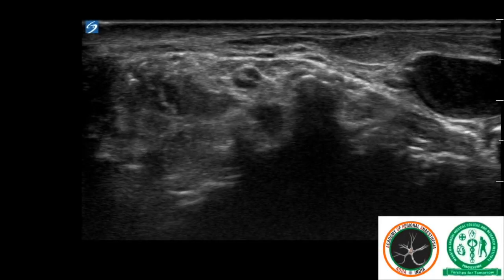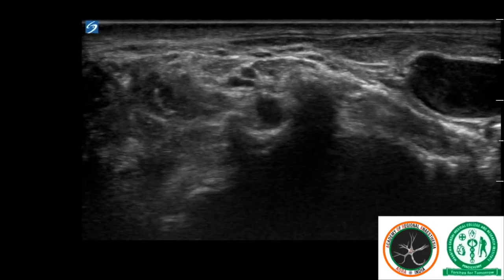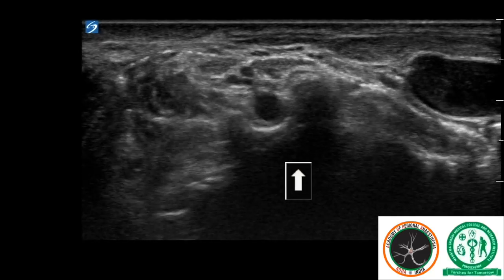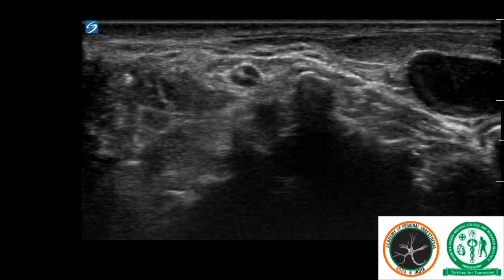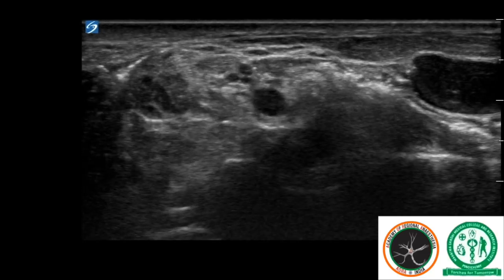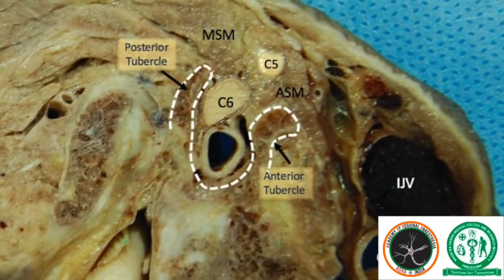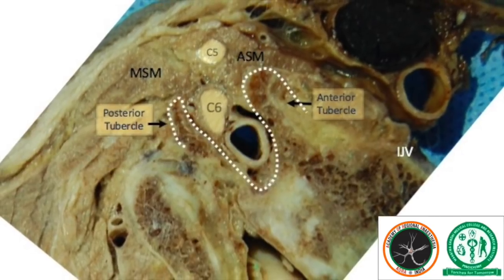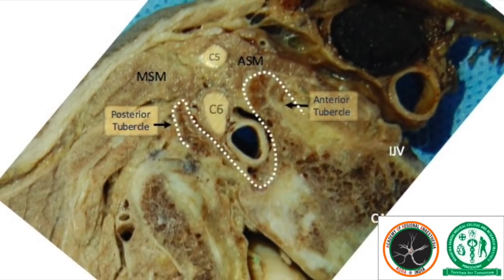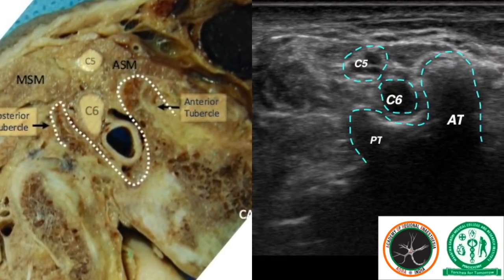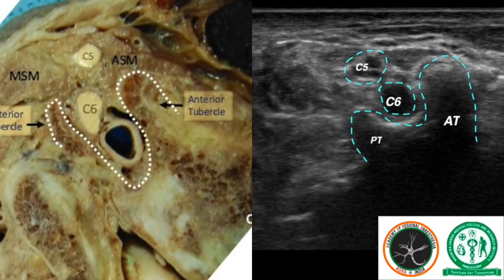At the C6 level, we assumed that it is the C6 root that appears above the bifid C6 transverse process. The actual anatomy revealed this to be true. The C6 appears as a single, round, hypoechoic structure appearing on top of the bifid C6 transverse process.